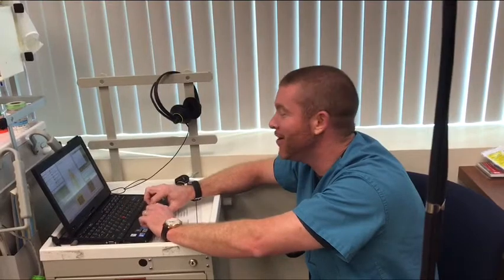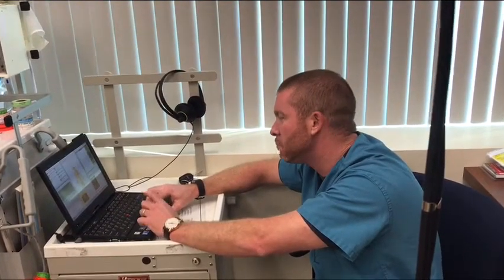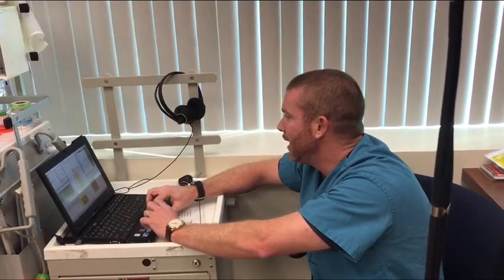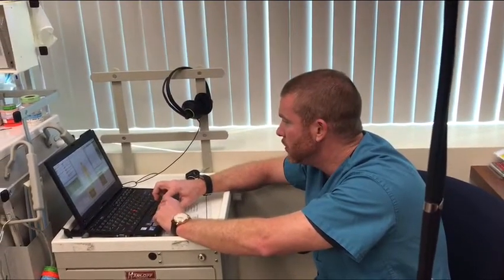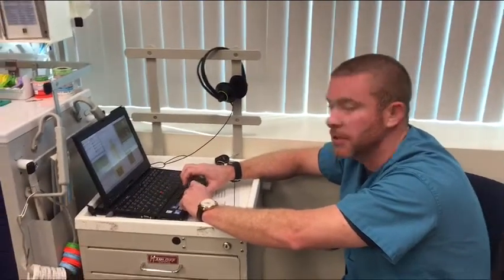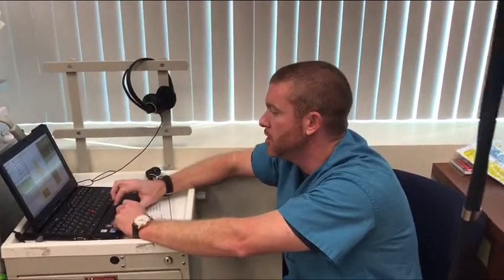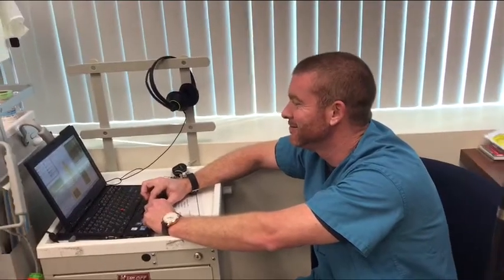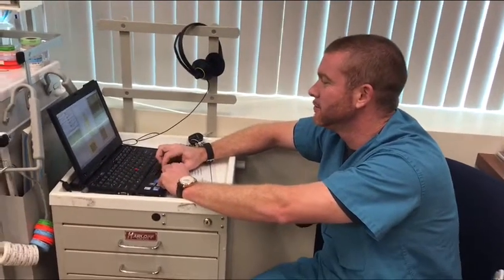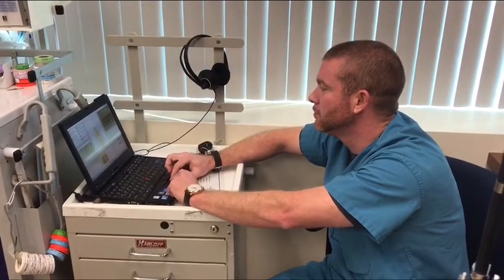All right, so you give 100 micrograms of fentanyl. Perfect. If you want to add anything, guys, you can add something anytime. It can be like a little team thing here. Is there any muscle relaxant too? Oh, yes, key, because that's not going to last through incision. Let's check the twitches before I give any further muscle relaxants.